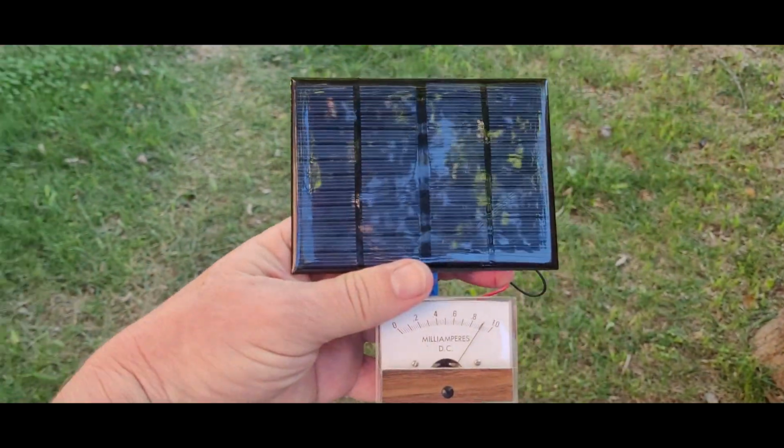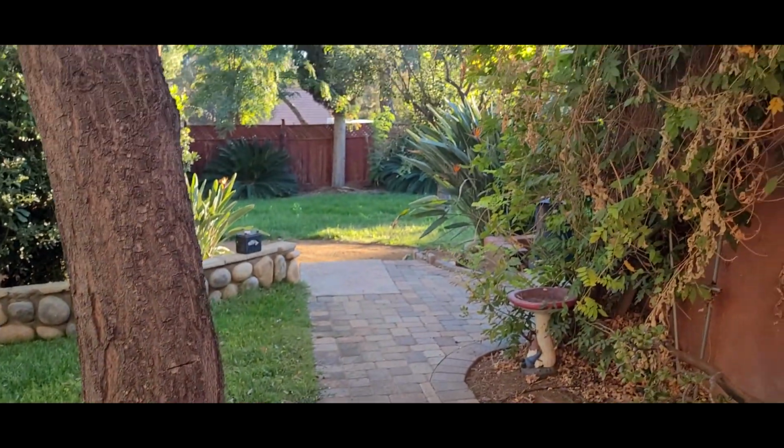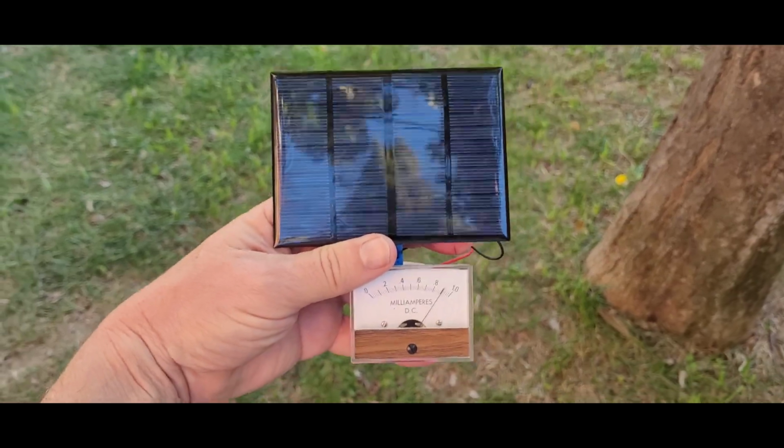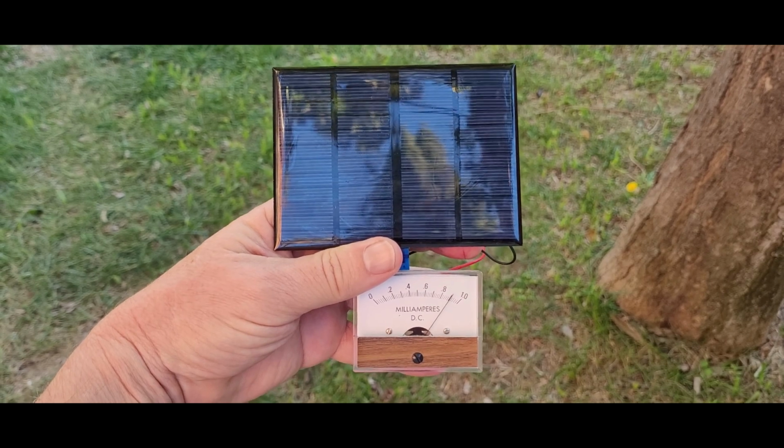So outdoors in total shade, and with the sun actually setting way off in the distance in the background, more than enough. Sunlight is fantastic for this, more than enough for full power, as you can see on the meter.